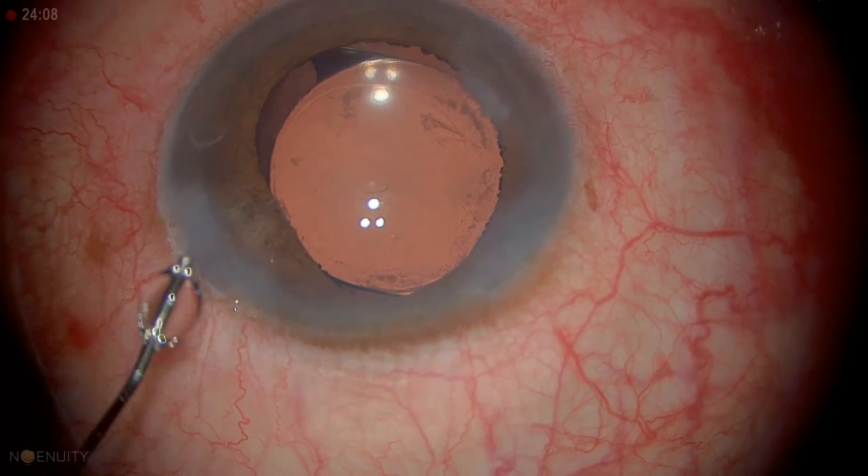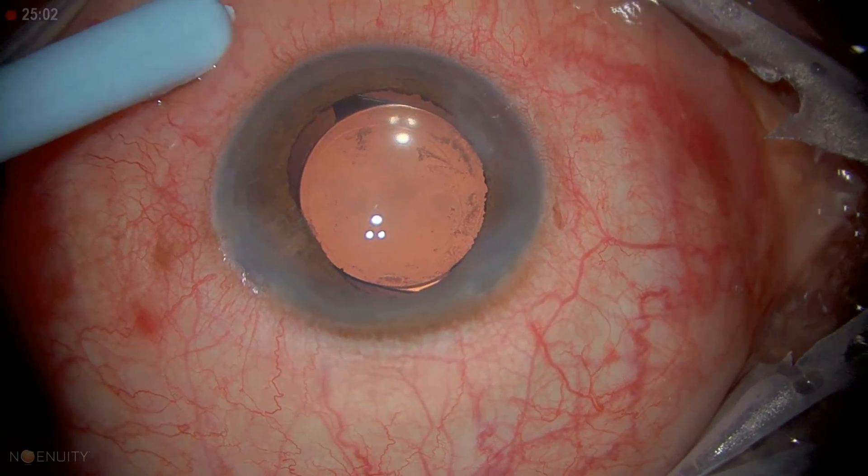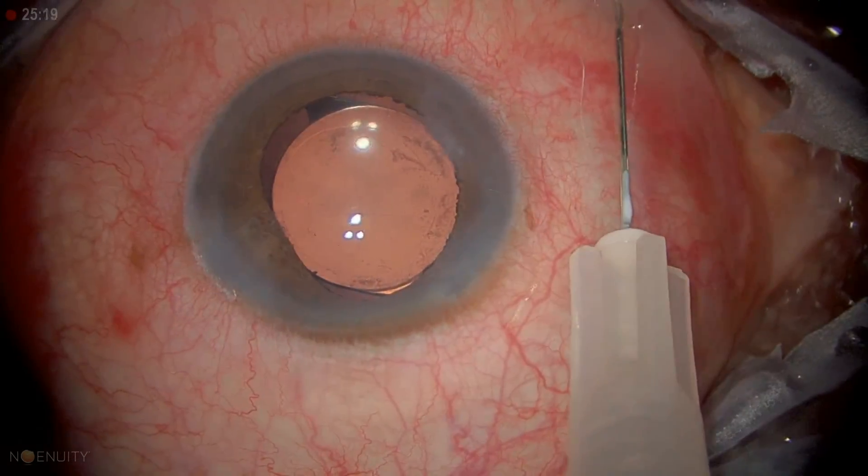We're going to go ahead and hydrate the wound. Okay, good — we're all done.